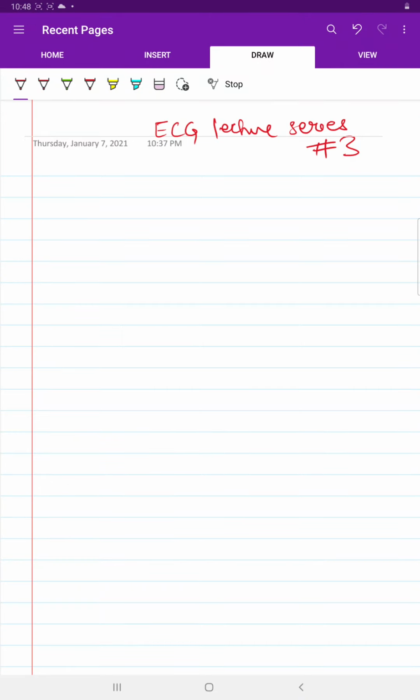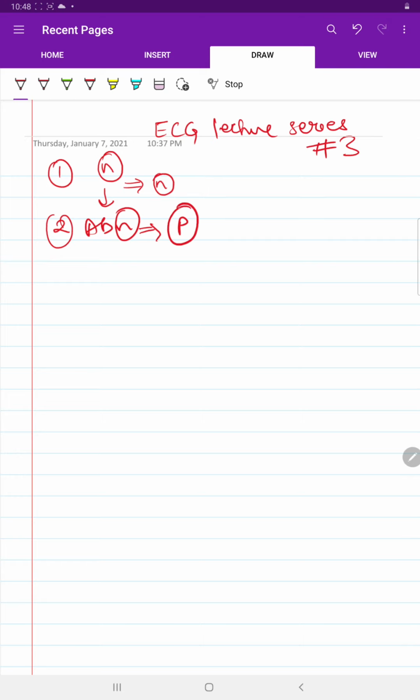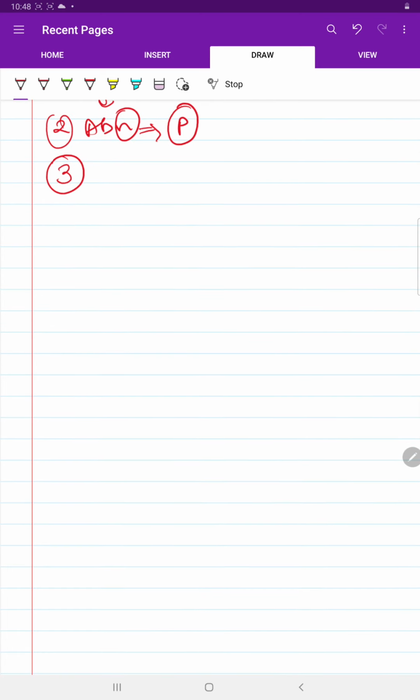Hope you have seen my previous two videos. This is the third video in the ECG lecture series. In the first video I discussed what is normal in the ECG strip. After knowing normal things, we can move towards the abnormal things. In the second video of my series I discussed the P wave. In today's third video I will discuss the PR segment.